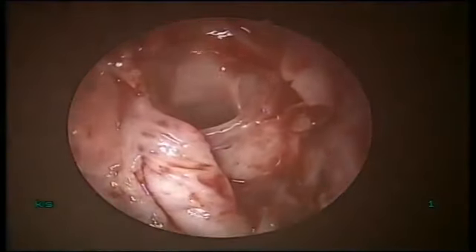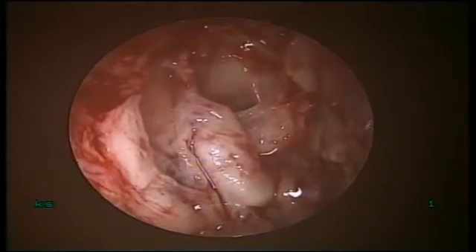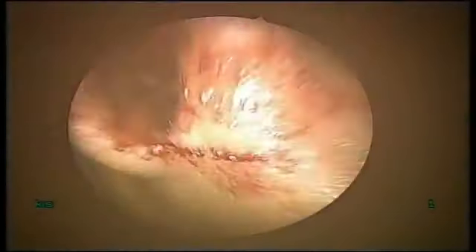See this? Yes, sir. See the lateral wall. Ultimately, after 2 months, you will see more than a centimeter wide opening in the lateral nasal wall, which is never going to close. Give me gel foam. Now this is my flap.